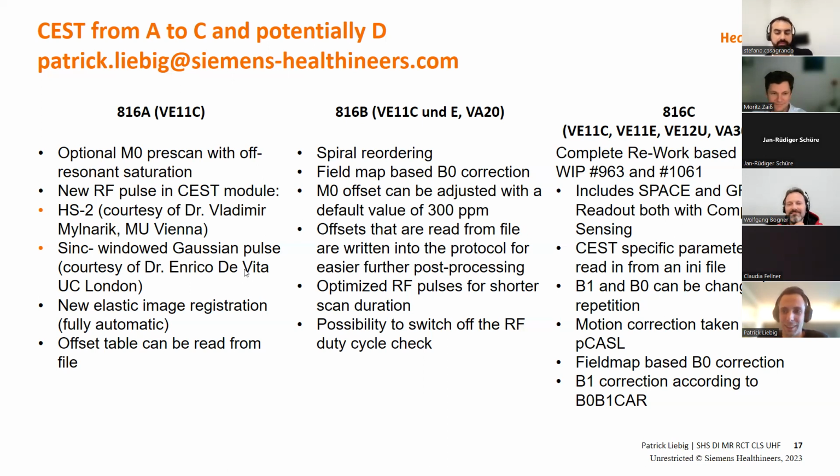If it doesn't work, then try to contact me, and we'll definitely find a solution. And worst case, really worst case, a different solution is of course the C2P by Moritz. I hope Moritz is in line with you. I would maybe add, we have more features in terms of the labeling, but fewer features in terms of compressed sensing and high resolution. That's the trade-off you have to make.